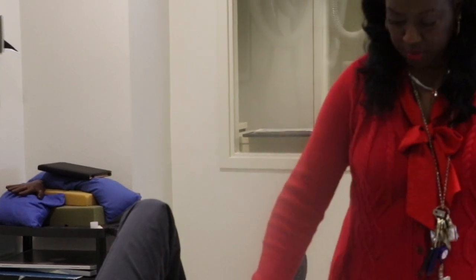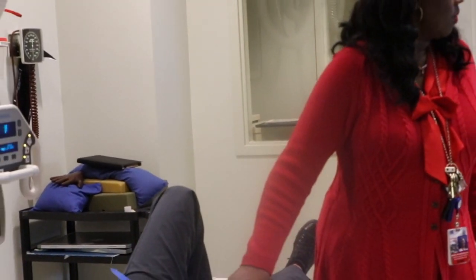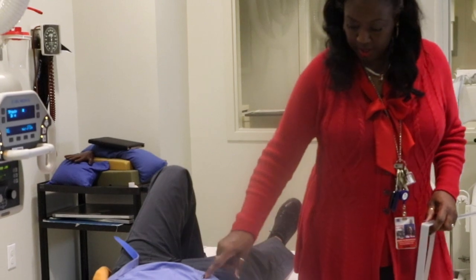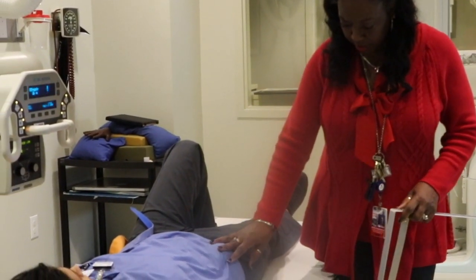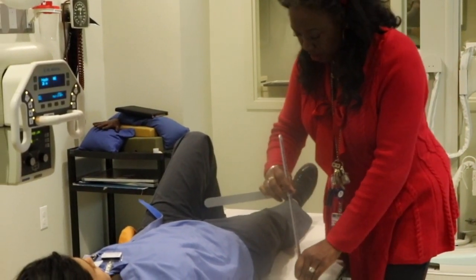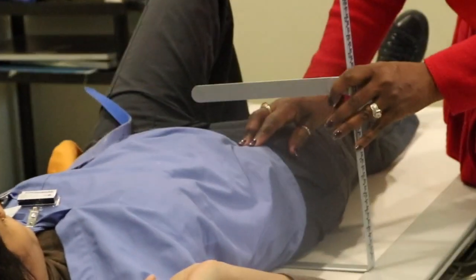So in order to determine whether we need an angle for the knee, we will locate the ASIS, which is the most anterior projection in the pelvic area. And this is our measuring device. We're going to slide it right up under our buttocks, and we're going to feel for the ASIS, which is right here.